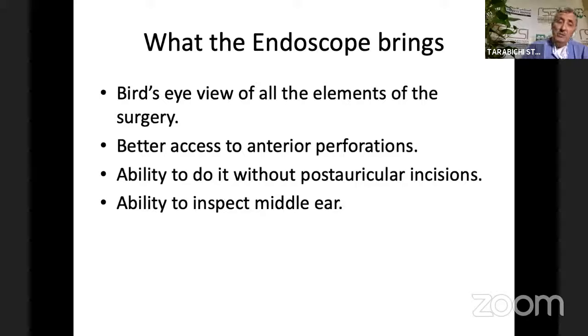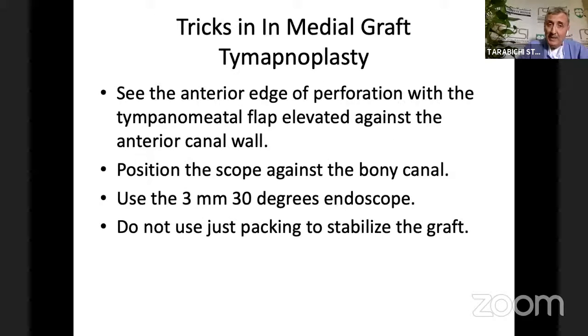So the endoscope really brings a bird's eye view of all the elements of the surgery: the perforation, the ear canal and the graft. And I cannot remember, maybe for the last 15 or 20 years, having done a post-auricular incision for a tympanoplasty.